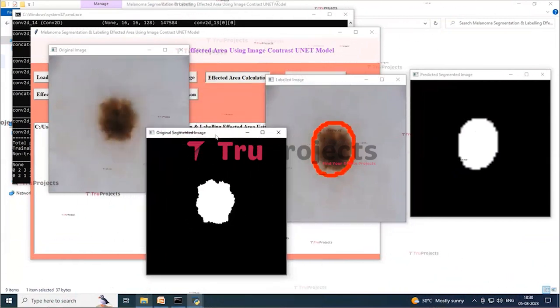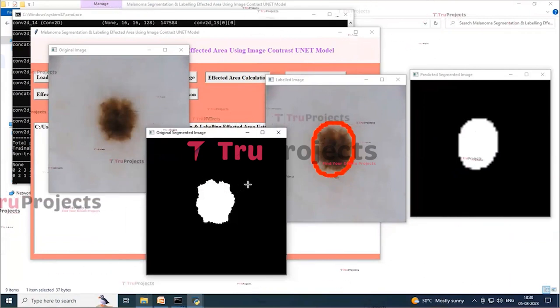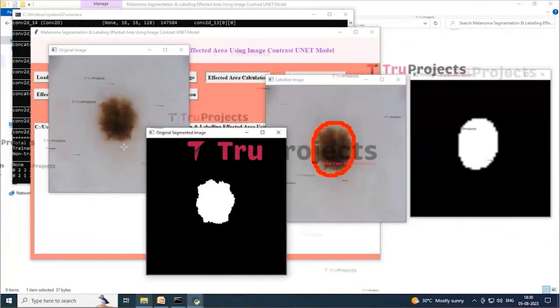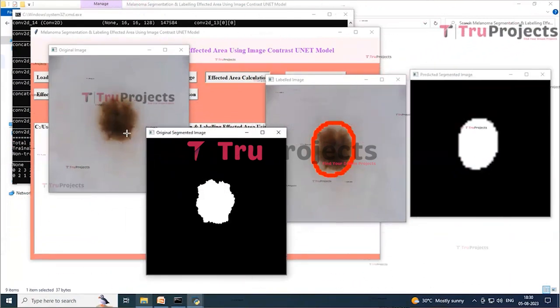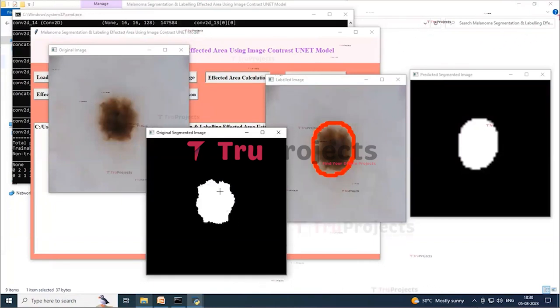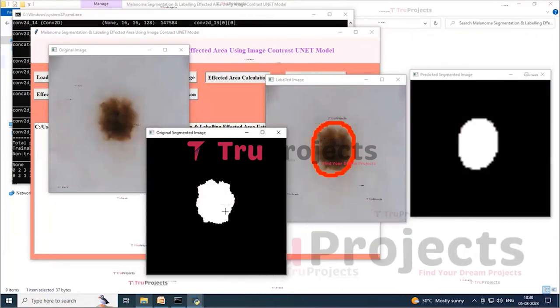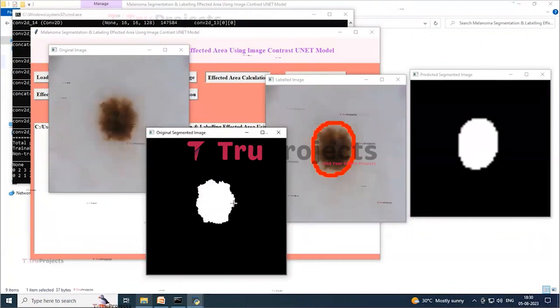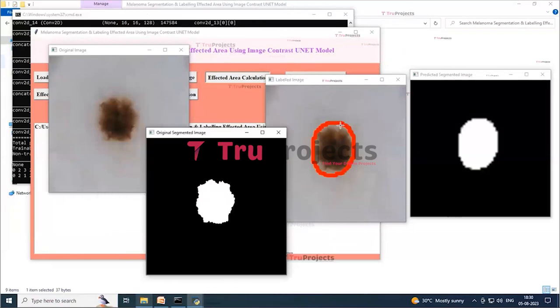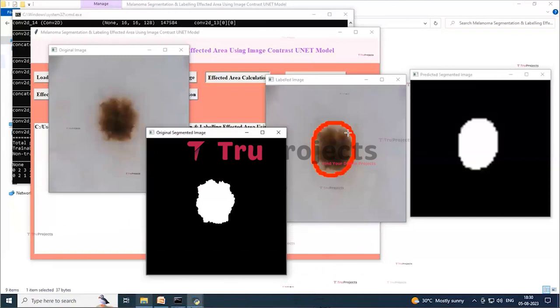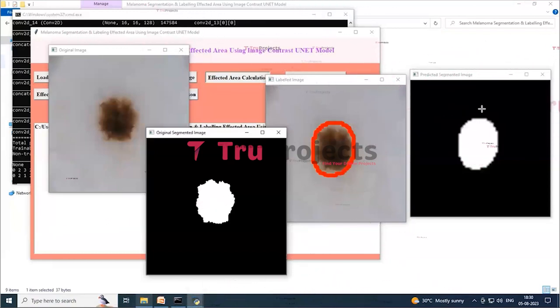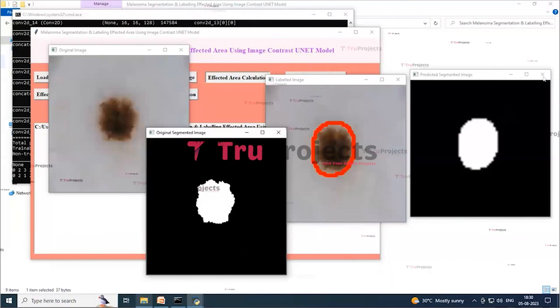In the output, three images are displayed: the first is the original image, the second is the segmented image showing the detected and segmented melanoma region with labeling, and the third is the predicted segmented image with the affected area marked. After reviewing, we close these images.